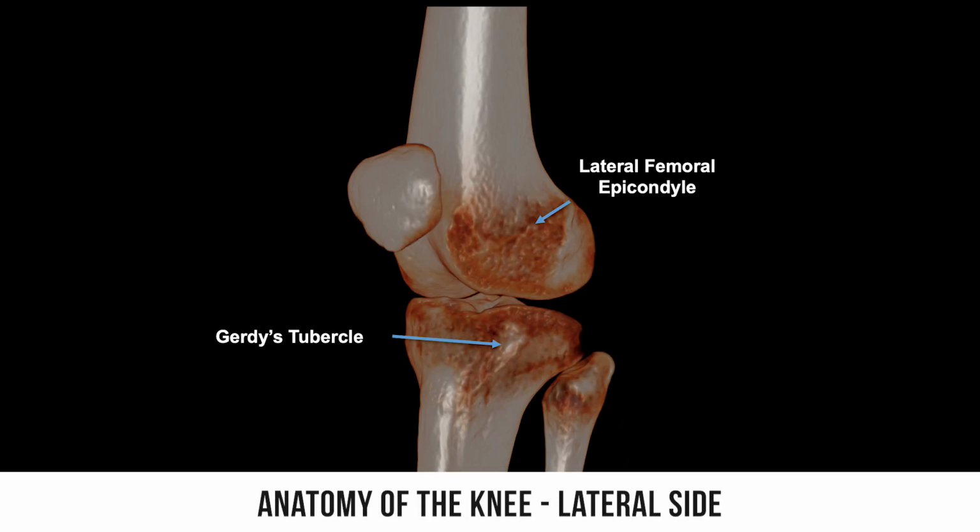In this new video, we will study the various structures of the lateral side of the knee, which I suggest studying from front to back for practical reasons. Let's jump right into the anatomy. Here is a diagram of the anatomy of the lateral aspect of the knee.